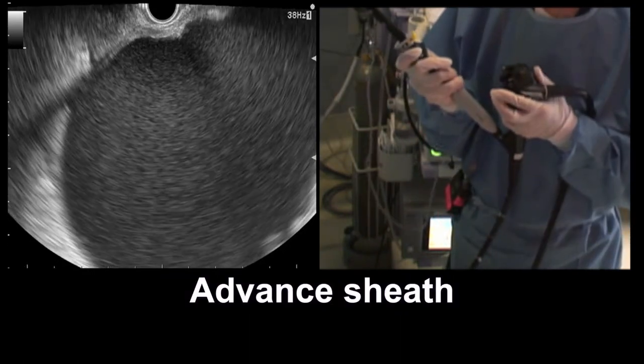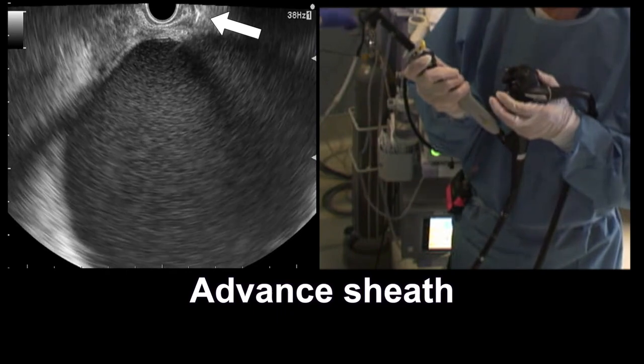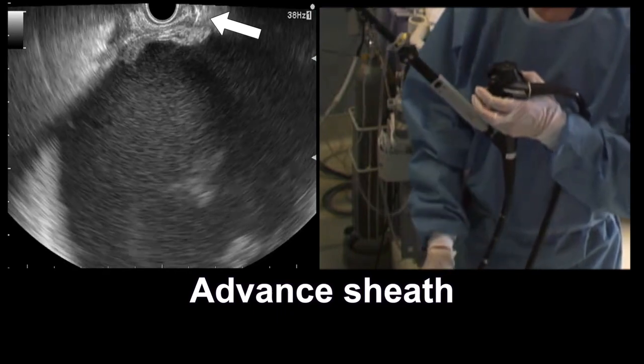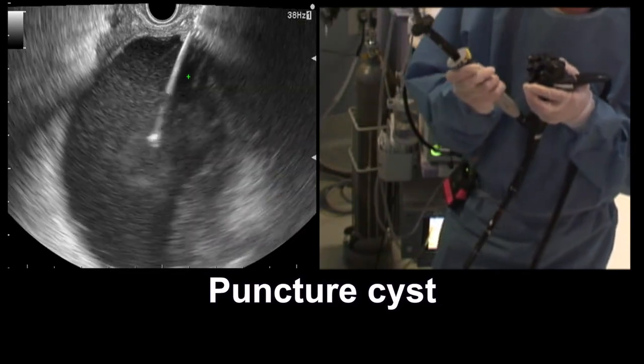We're very echogenic at the top of our screen. There it is — you can see the tip. Step on the pedal. We're inside of the cyst now.